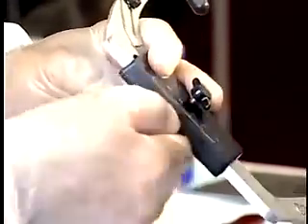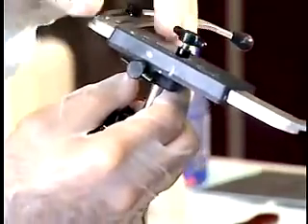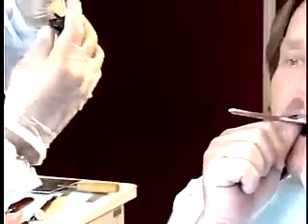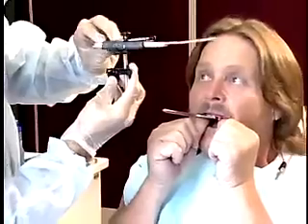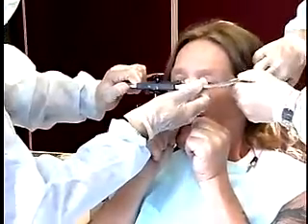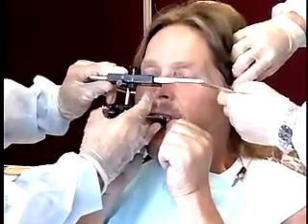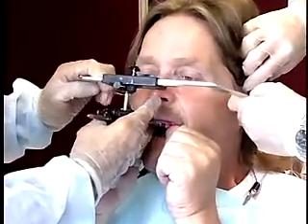Note: always explain to the patient that you are going to use a caliper-like device for the procedure and that you will need his or her assistance. Assure the patient that he or she will undergo no discomfort, but will feel a little pressure. Tell the patient that it will only take a few minutes to complete the procedure.